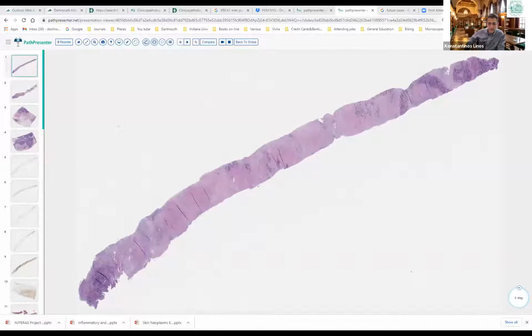Let's keep looking. There are some more hypercellular areas here. There are solitary cells, but not significant pleomorphism, though I would say quite hyperchromatic. I don't see a lot of mitotic figures here. There is some myxoid background in these areas, and there is some nucleomegaly again with a little bit of eosinophilic cytoplasm. And these cells look a little bit more dense. Again, we have a myxoid background and a lot of necrosis.